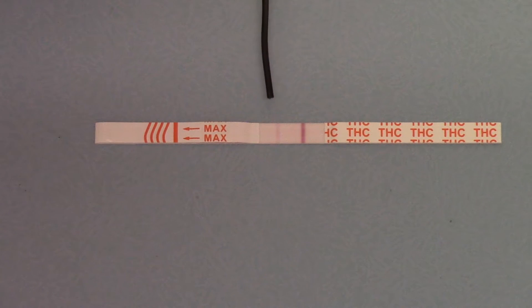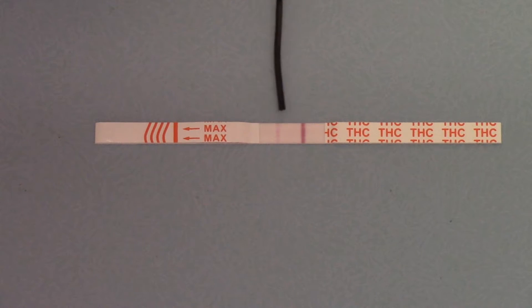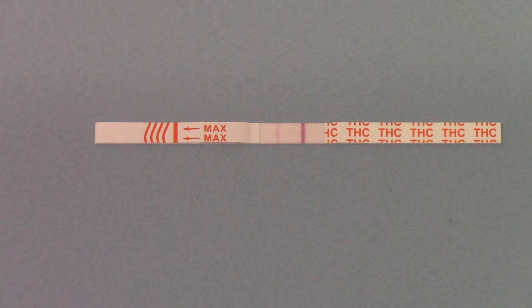What you'll see developing here, nearer the dipped end, is the test line forming. At this time you've still got a pink discoloration on the background of the results area, and the test line is significantly lighter than the control line. That still indicates a negative detection of cannabis at 25 nanograms.